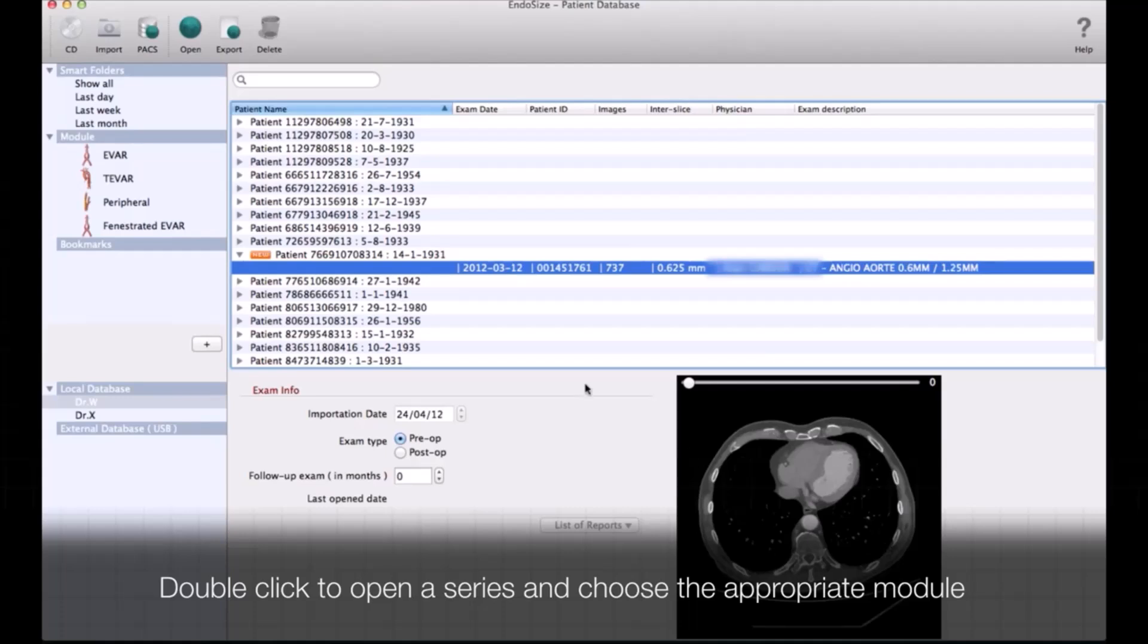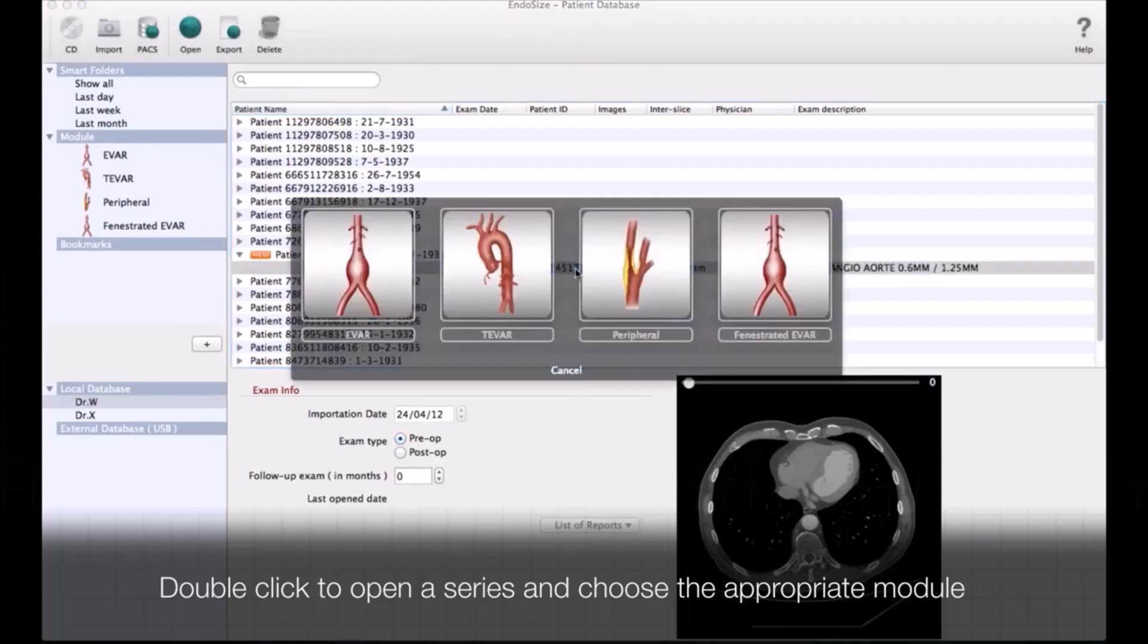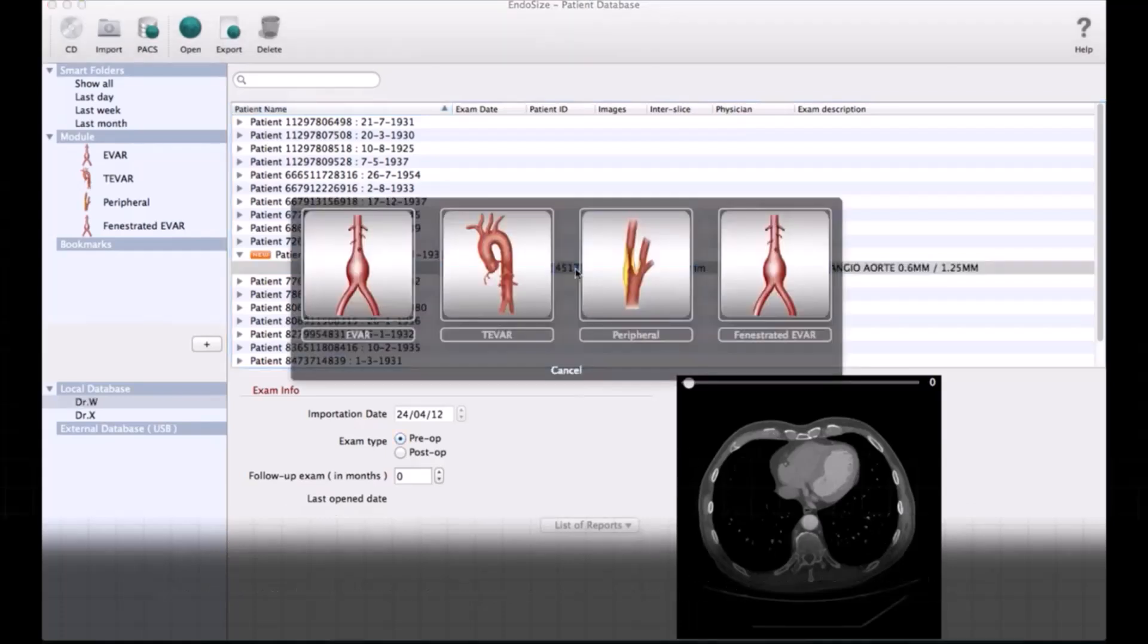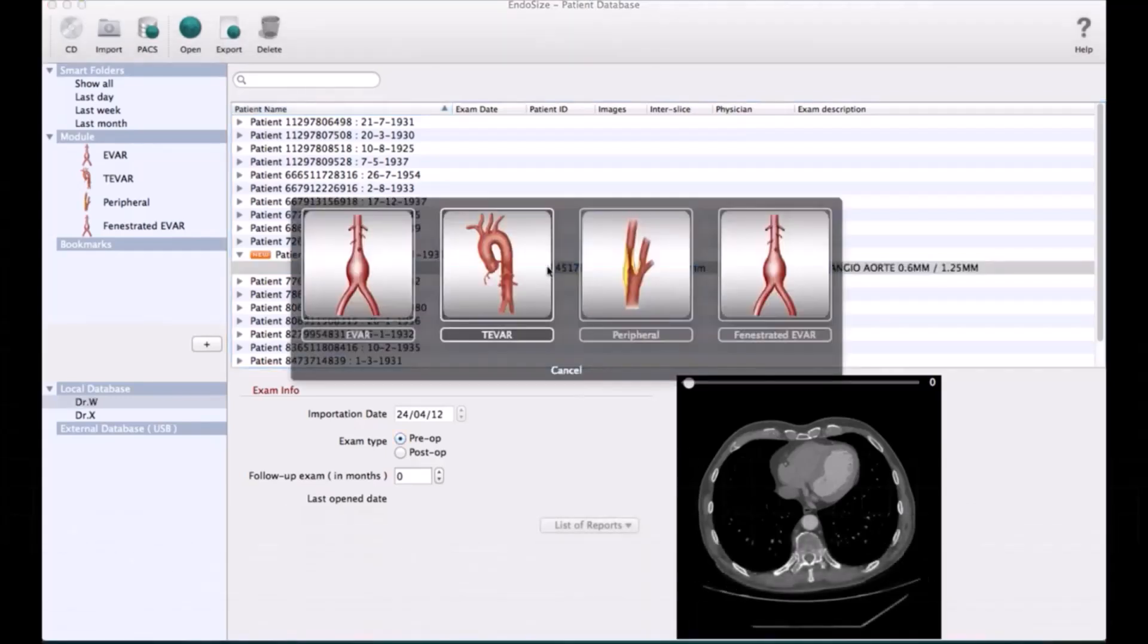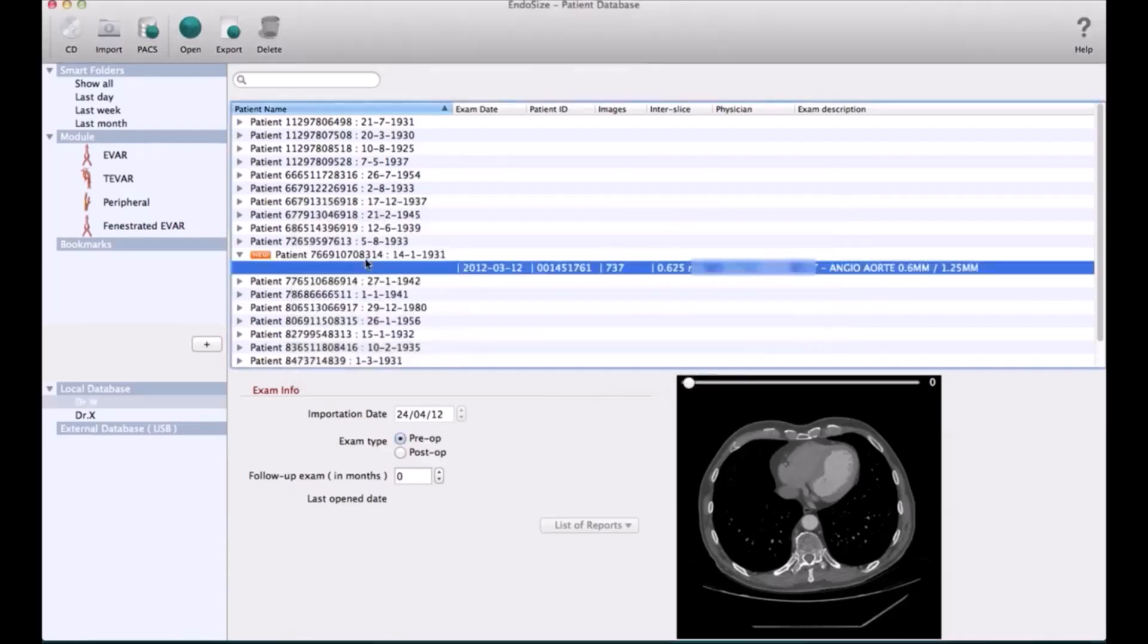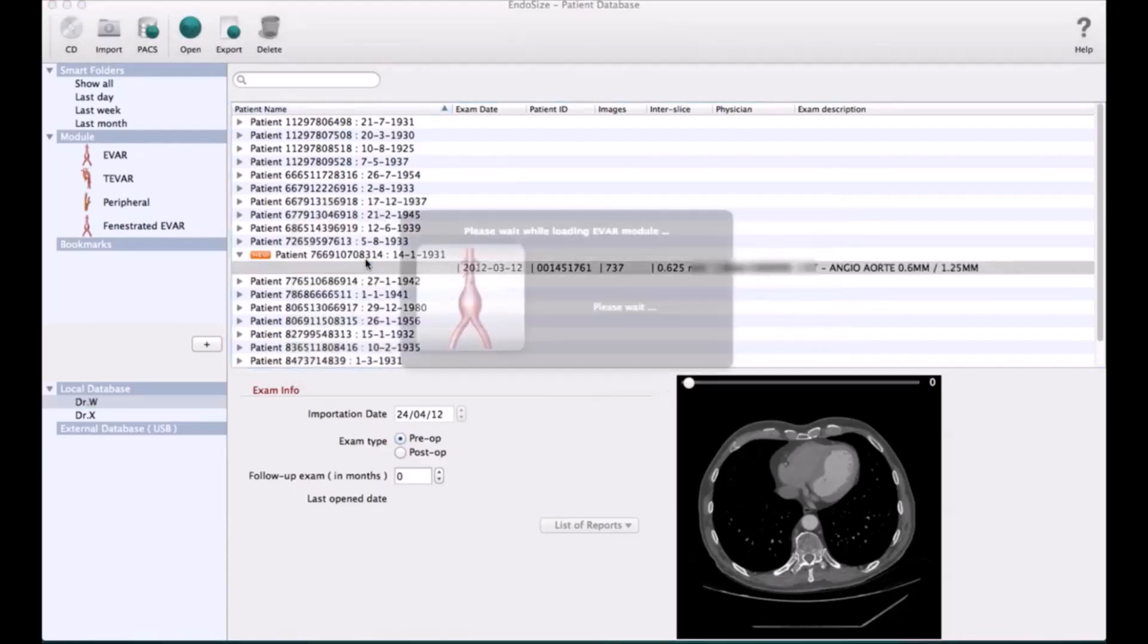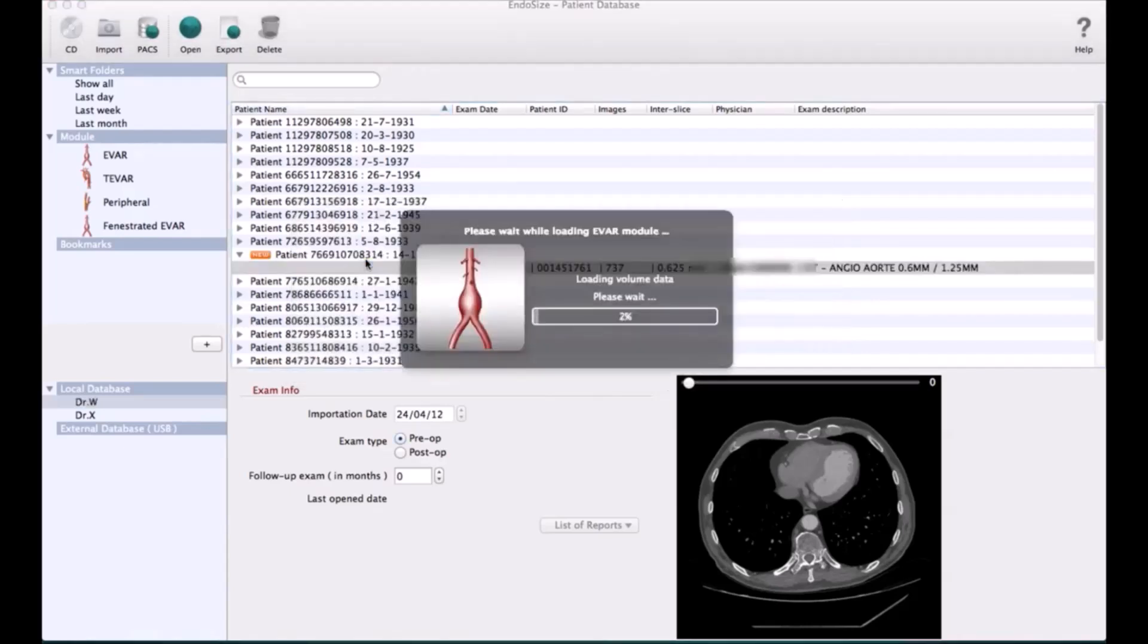Then it will import the system. You select this is the EVAR, and after that it will import into the EndoSize, Thereneva.